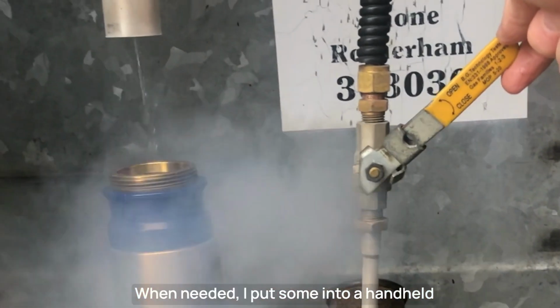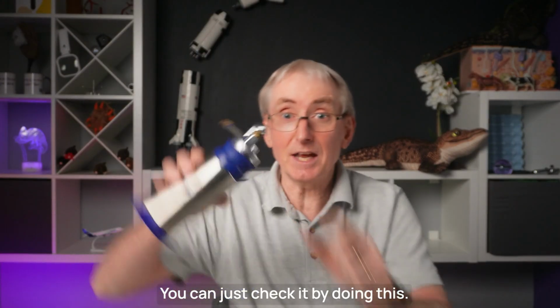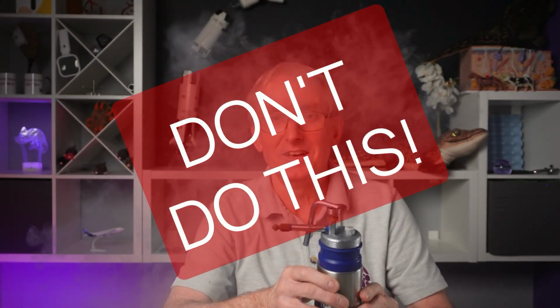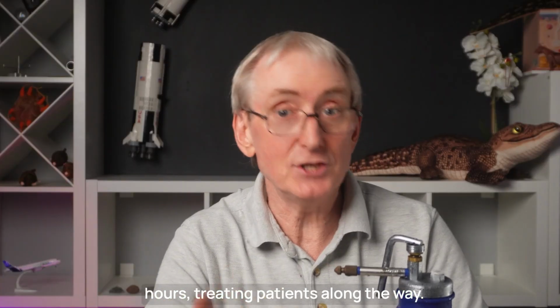When needed, I put some into a handheld flask, which also has a pressure release valve. You can just check it by doing this. I find a full flask will last me around 4 hours, treating patients along the way.